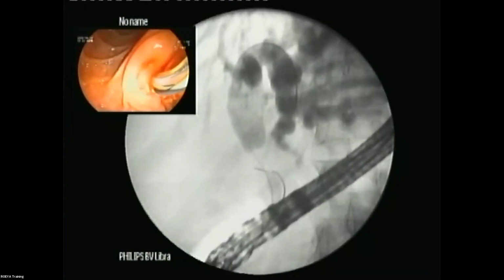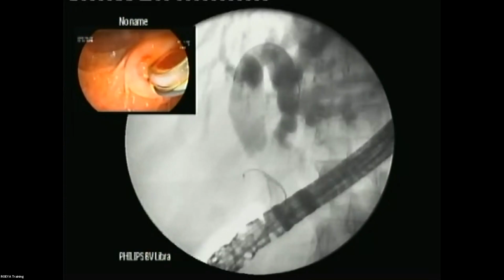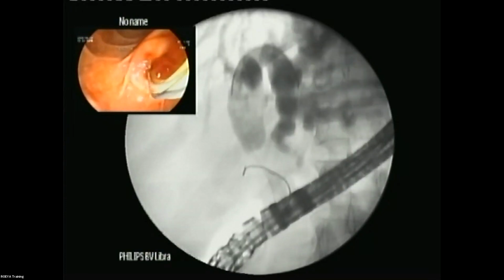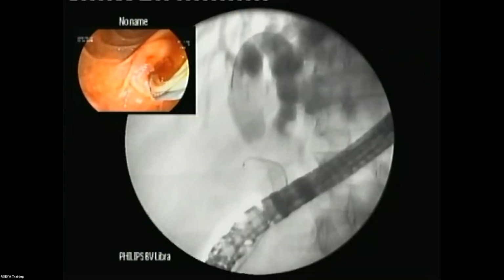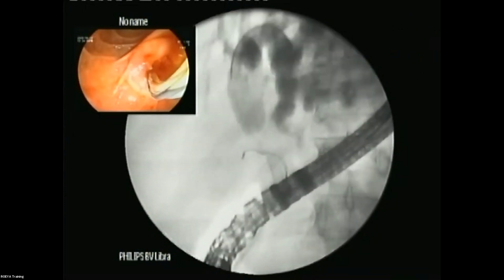Dr. Hani and Dr. Mustafa, you have 3 questions coming now. First one, can you use a spyglass in this case? Okay, Hani will reply. Hani is better than me with the spyglass. Difficult question, huh? It's coming from Mariam Zaghlul.